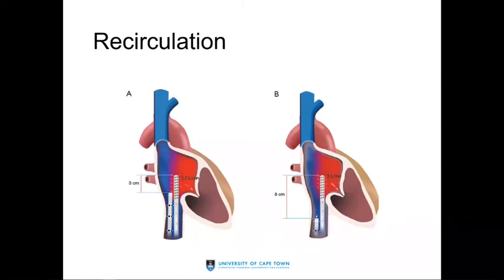Just bearing in mind that the drainage cannula does drain from the proximal holes. So actually when we put the tips and they look a little bit too close together, that might be by design. And also that means that it's probably sitting in a bigger vessel and it won't suck in the side walls of those vessels and occlude, and you won't have to give your patient as much volume in order to maintain flows.